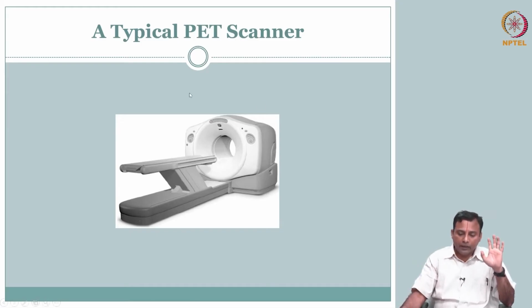So a typical PET scanner looks something like this, nothing much different, everything is enclosed, it looks very similar to, say, a CT or an MRI.